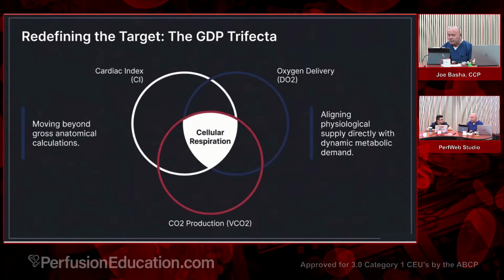I think there are still some technological concerns in doing this the right way, but it does sound like a very interesting concept when you're evaluating cellular respiration. It's a metric that can be added to everything else that we do to tell us that we're doing really good. And then, of course, you have oxygen delivery, DO2, DO2I, all leading to evaluating this fundamental thing, which is literally at the microcirculatory level.